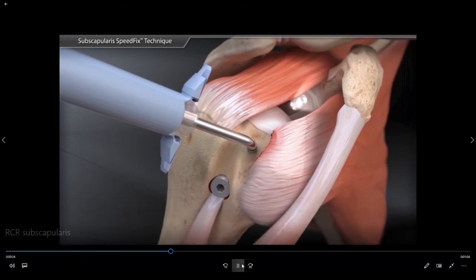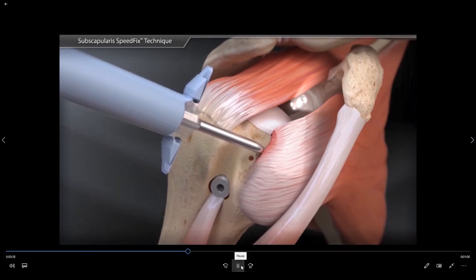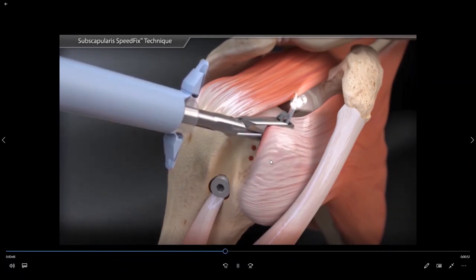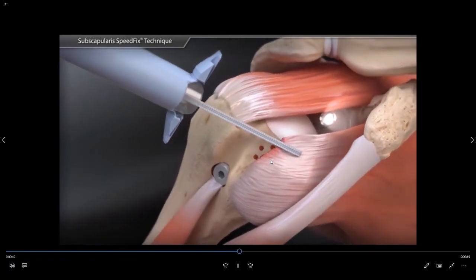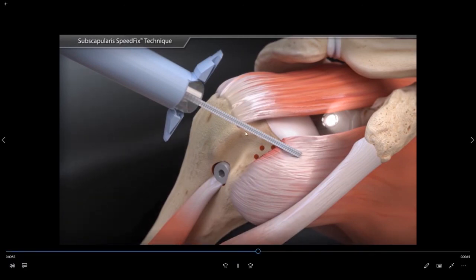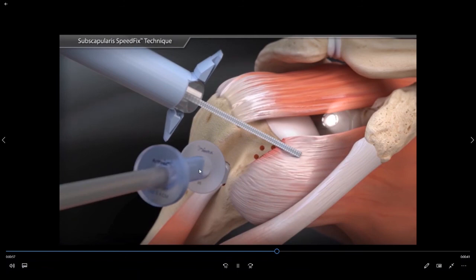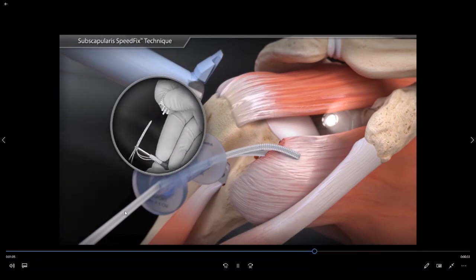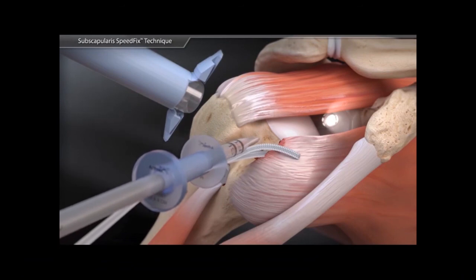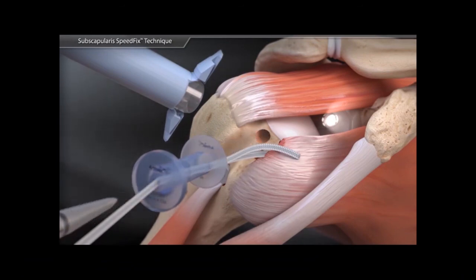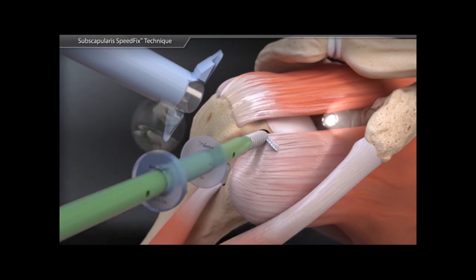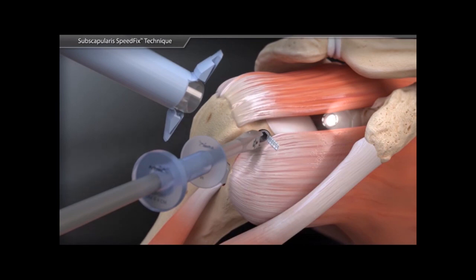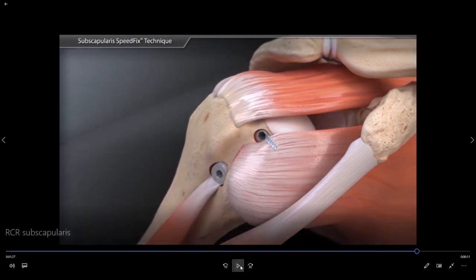At this point we're going to prepare the bone where the rotator cuff tendon needs to be reattached. We want to create a nice bony bleeding surface so that when we do our repair the tendon comes back to the bone. Now we have placed a stitch into the tendon. We will create additional access with another portal in the front, bring the stitches out the front of the shoulder, and place them into an anchor. We then punch a hole in the bone where we want the tendon to reattach, slide the anchor down along this stitch, and screw the anchor into position, effectively stitching the tendon back to the bone. We will then remove the excess — and this is your final repair.